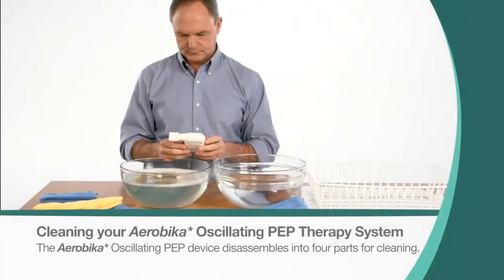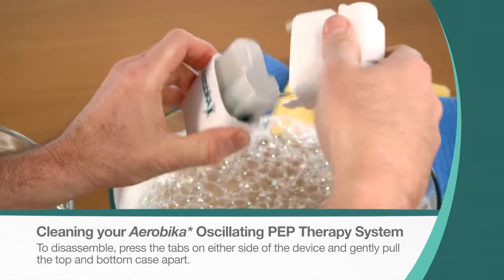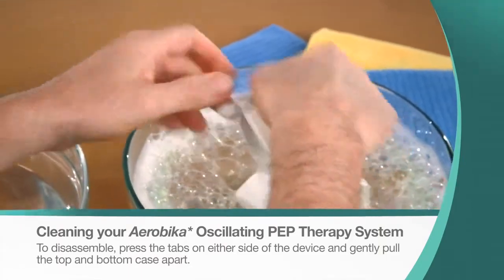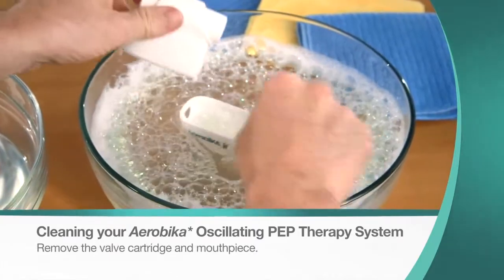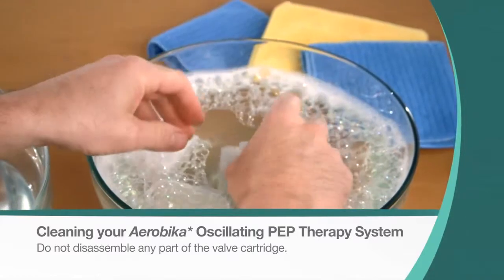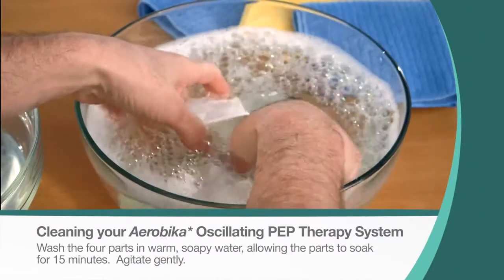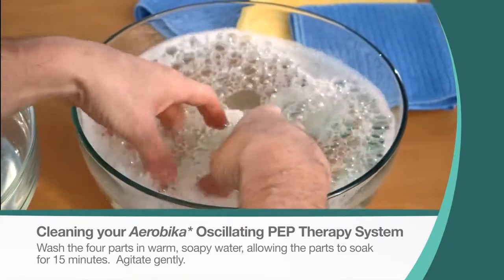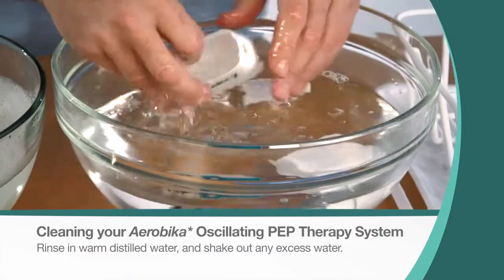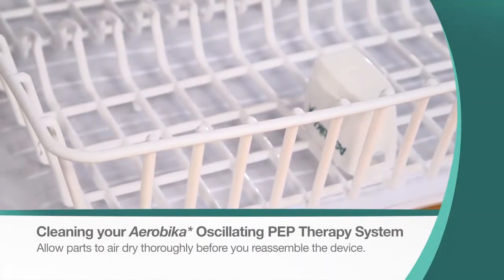The Aerobica Oscillating PEP device disassembles into four parts for cleaning. To disassemble, press the tabs on either side of the device and gently pull the top and bottom case apart. Then remove the valve cartridge and mouthpiece. Do not disassemble any part of the valve cartridge. Wash the four parts in warm soapy water, allowing the parts to soak for 15 minutes. Agitate gently. Rinse in warm distilled water, shake out any excess water, and allow parts to air dry thoroughly before you reassemble the device.